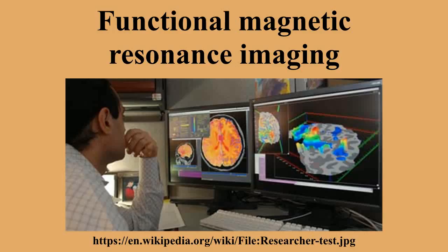Below a TR of 1 or 2 seconds, however, scanning just generates sharper HDR curves without adding much additional information. Temporal resolution can be improved by staggering stimulus presentation across trials. If 1/3 of data trials are sampled normally, 1/3 at 1s, 4s, 7s and so on, and a last third at 2s, 5s and 8s, the combined data provide a resolution of 1s, though with only 1/3 as many total events. The time resolution needed depends on brain processing time for various events.